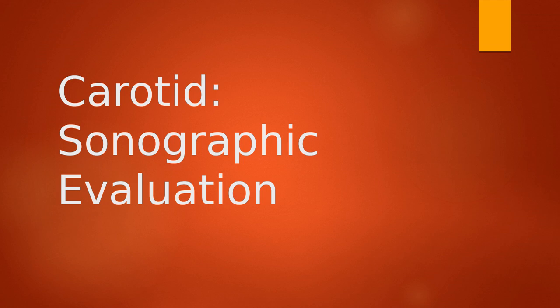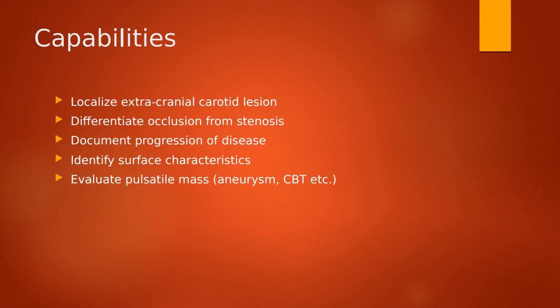Okay guys, this is going to be a little bit quicker than our anatomy PowerPoint. We're just going to talk about how we perform our carotid exams. This should be a little bit of an accessory to what you learned in clinical, but we're going to talk about some very particular things with this procedure itself.